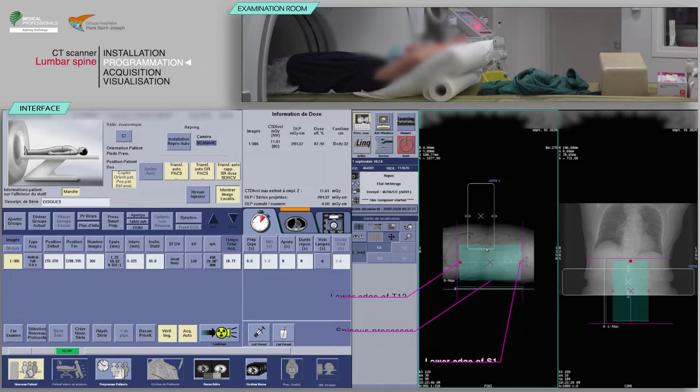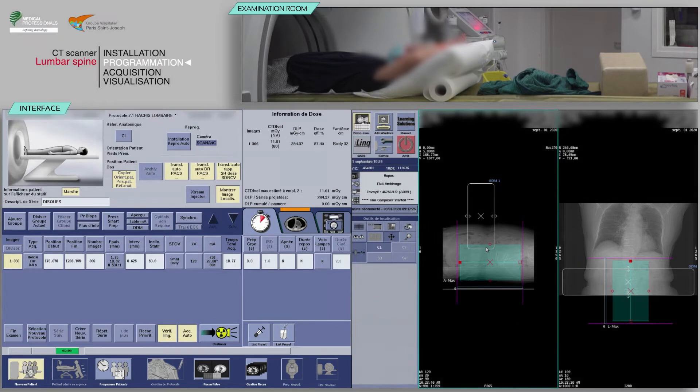Place your slices box on the lateral localizer, covering from the lower edge of T12, superiorly, to the lower edge of S1, inferiorly.